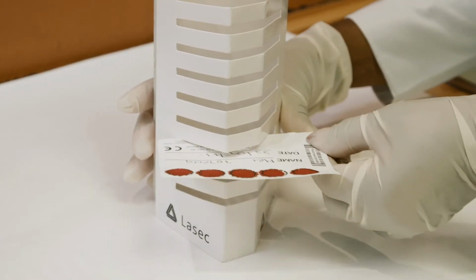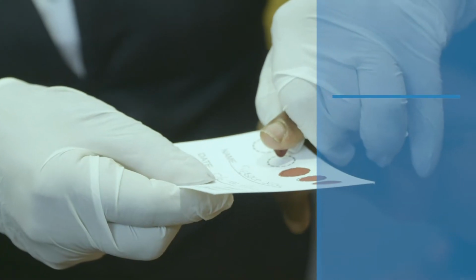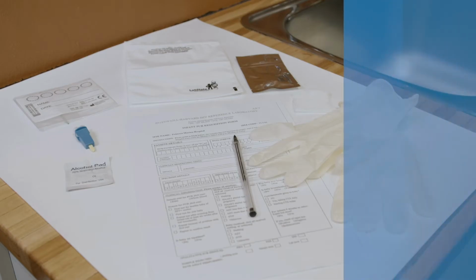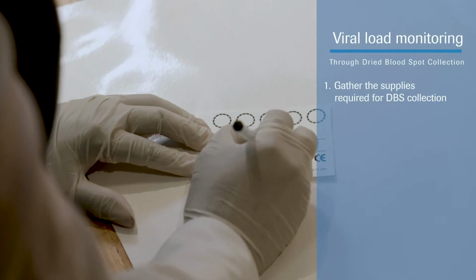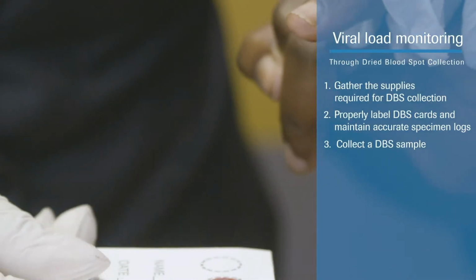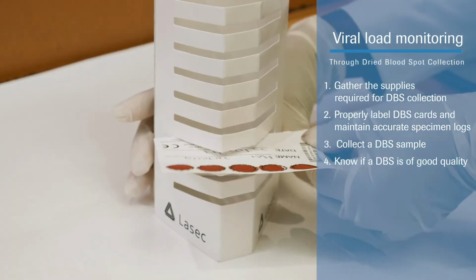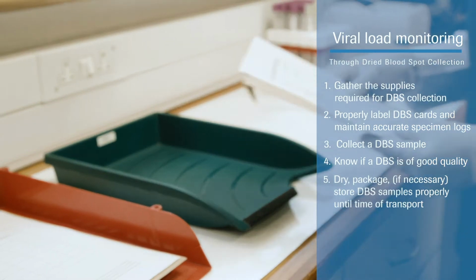In this short film, we will demonstrate the skills you need to collect high-quality DBS samples. Remember, a test result is only as good as the specimen collected. We will show you how to: 1. Gather the supplies required for DBS collection. 2. Properly label DBS cards and maintain accurate specimen logs. 3. Collect a DBS sample. 4. Know if a DBS is of good quality. 5. Dry, package, and if necessary, store DBS samples properly until time of transport.